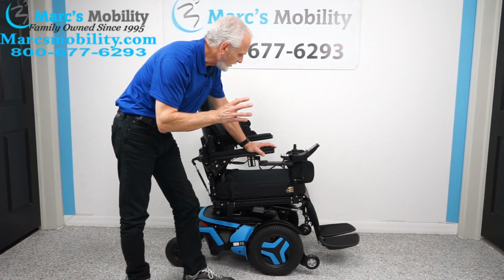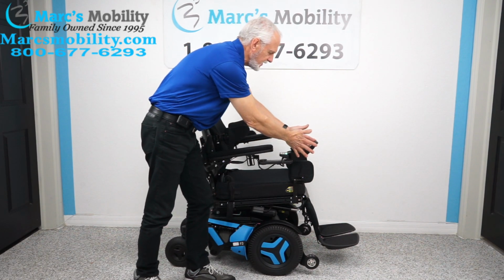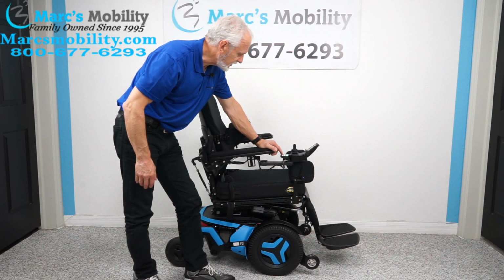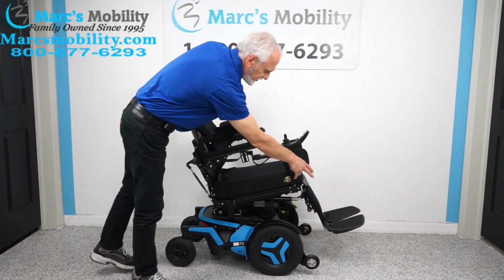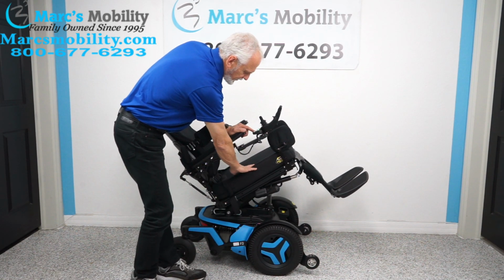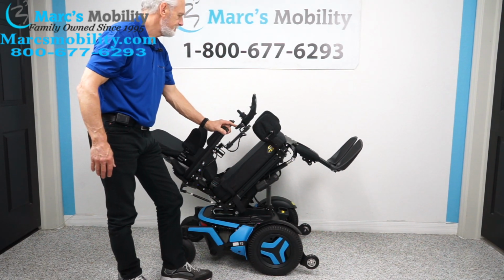But first of all, we're going to turn the power on. And if you want to make the seat tilt, recline, and legs go up, you can do it through the joystick. I like to use the switch box. It's quicker for me. So the second button would be the electric tilt. If I push that button, you can see the base right here going back. Of course, it's going to take the legs. It's going to take the back as they're all connected together, okay? This is good if you want to relieve pressure off your bottom, pressure off your back. You want to relax or just have some circulation in your legs.